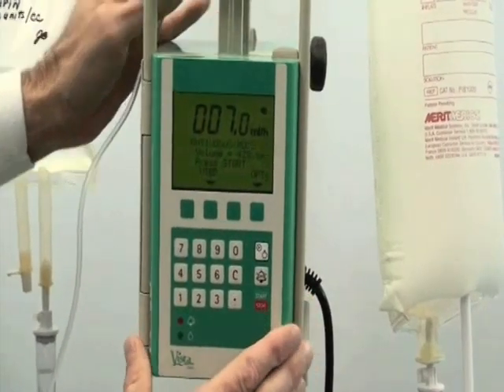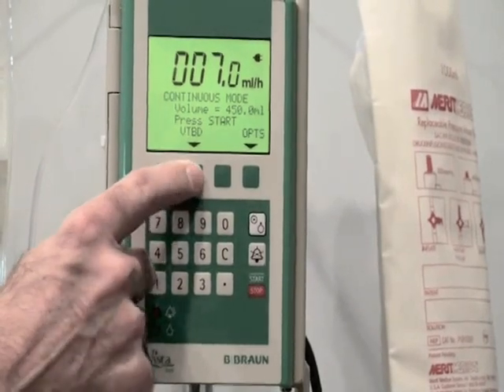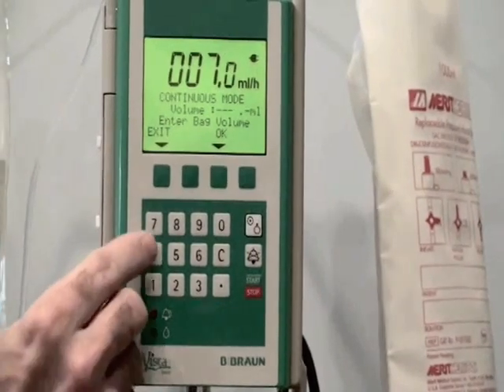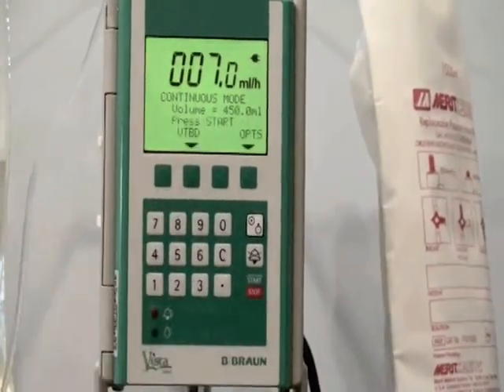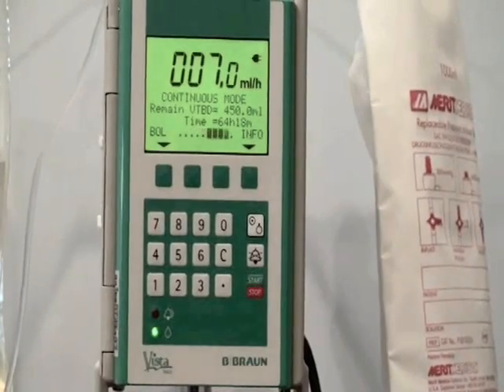Once the change has occurred, the new tubing is threaded through the infusion pump. You will press the VTBD to enter the new bag volume. Press C on the keyboard to clear the remaining volume, then enter the volume of the new bag. Press OK to accept the new value. Press the green Start button to start the infusion.